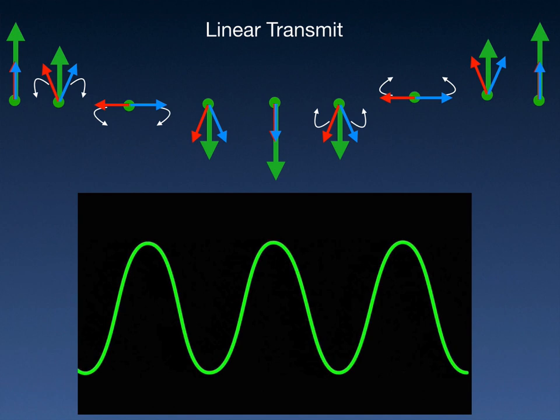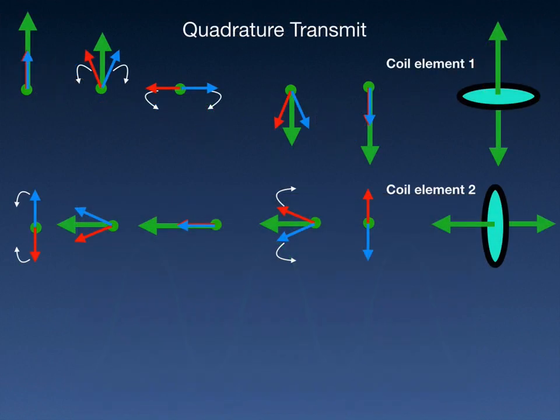The earliest types of RF coils for MR imaging were all linearly polarized, and in this configuration, both transmission and reception of electromagnetic radiation took place along a single axis. In the transmit mode, linearly polarized coils are inefficient in that half their power is wasted, as previously mentioned. In the receiver mode, again, they're not capable of extracting the full information from the MR signal.